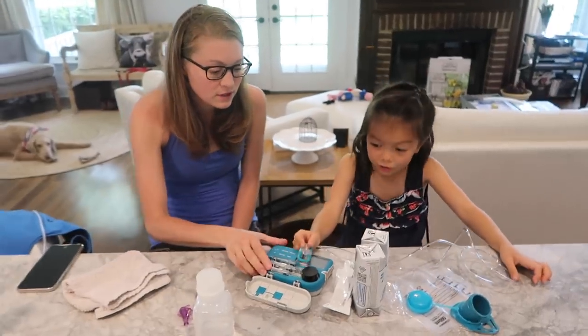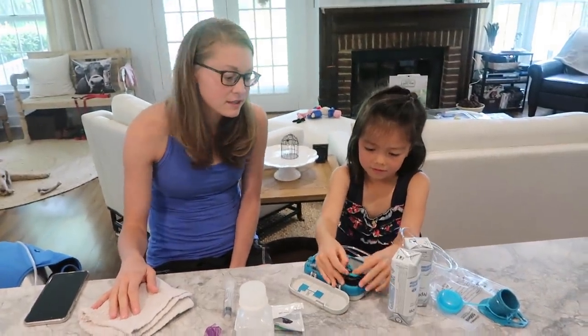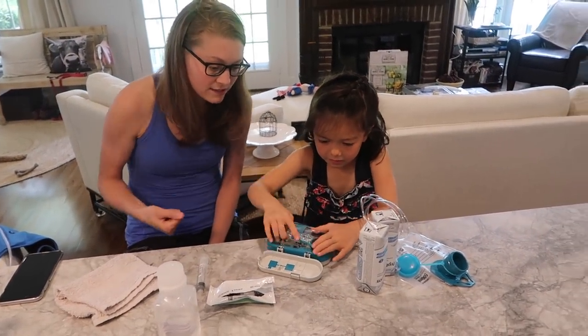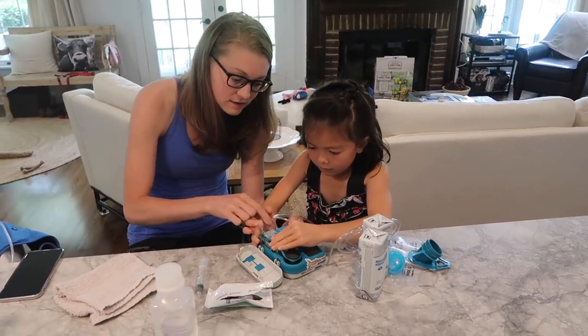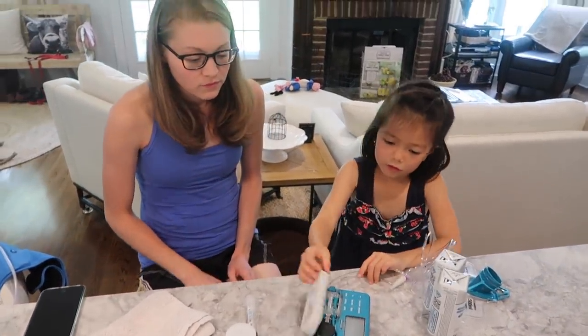This looks easy! All right, here we go. I don't even have to explain it for this part — you got it. So then you just pull this part, pull it this way. It's pretty hard, and then this cartridge will click into place. Yep, and then you can close the door.